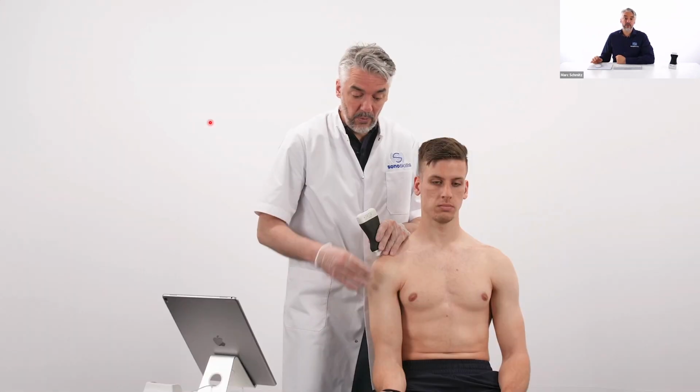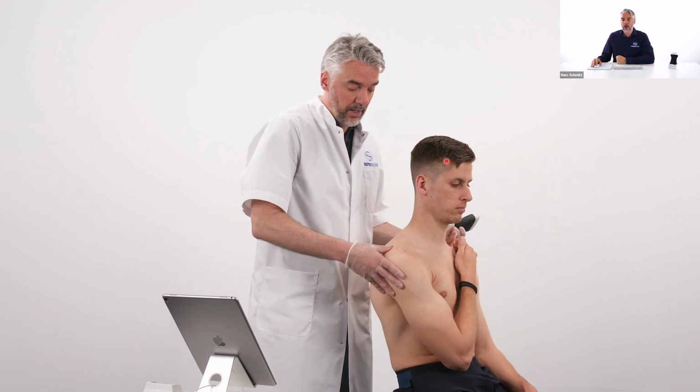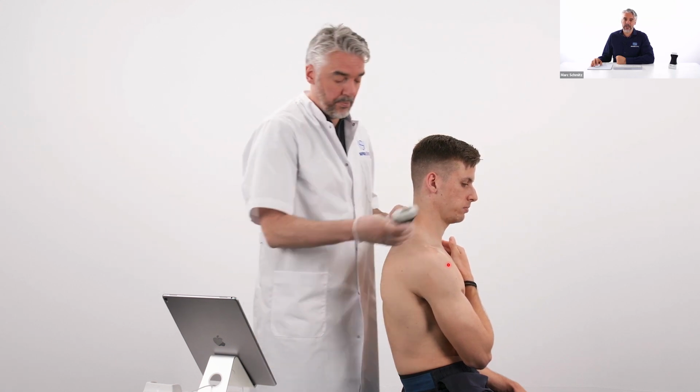And that is not what we want to see. So we definitely want to see a stable situation. Again, placing the hand on the other shoulder. Now going to the last bit of the demo, looking at the infraspinatus.